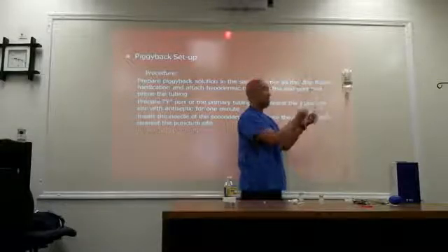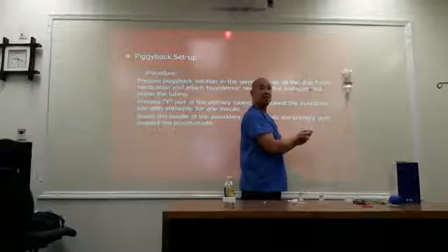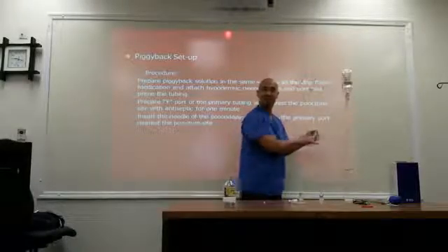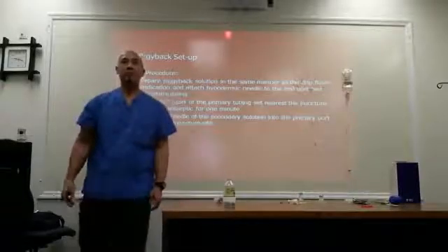Okay, I'm going to clamp this off manually. Here, can you guys see that? Okay, that's piggyback. I just connected my line into the existing line. Piggyback. That's all it is. Or there are some other ports they have so that you can inject it.